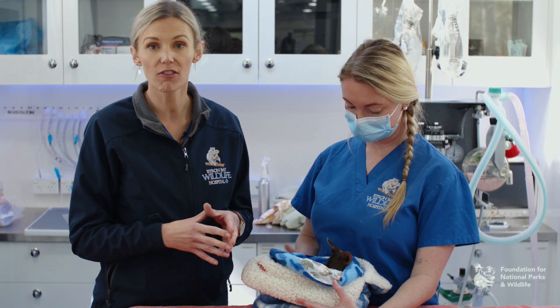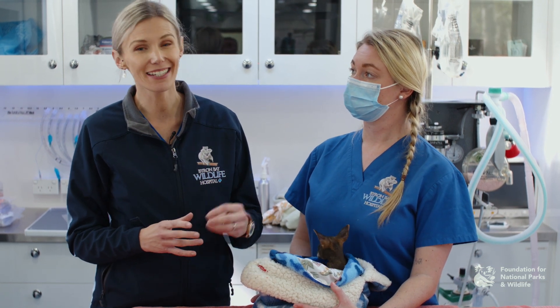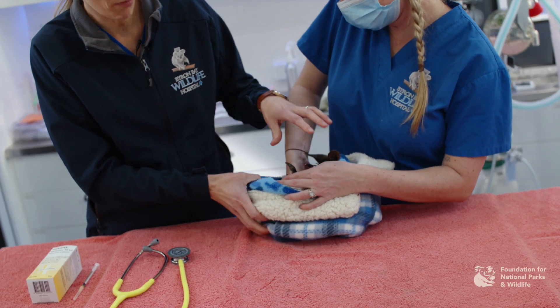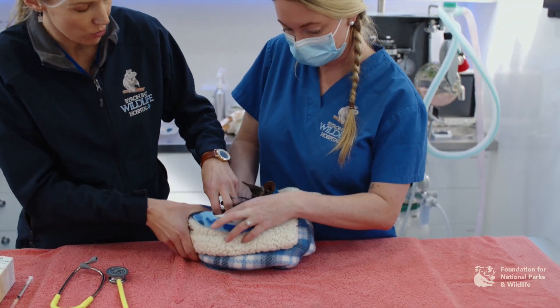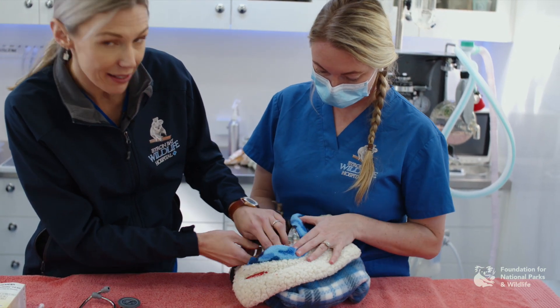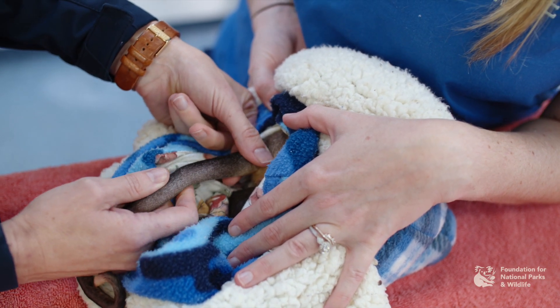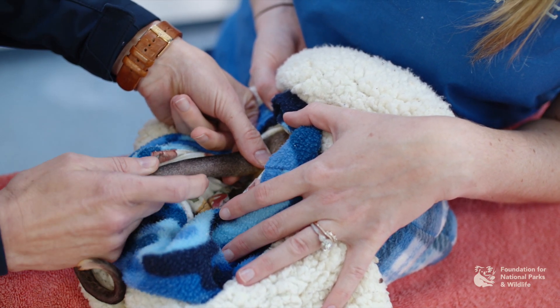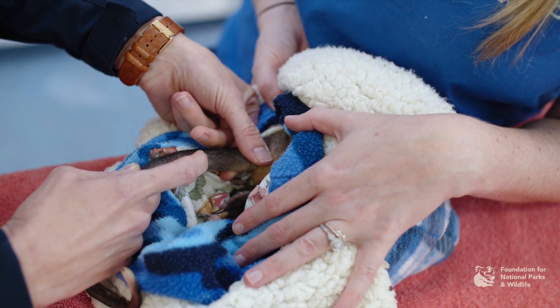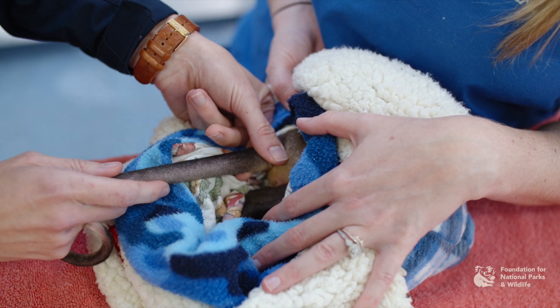With your macropods, probably the easiest place to try first is the lateral tail vein or your medial metatarsal vein, because they're going to be bigger and also easier to do with a conscious animal. You can keep your macropod in his blanket and keep him nice and calm. For your tail vein, if you hold the base of the tail, you allow the pressure to build. You'll actually see a faint line going down the side of the vertebral processes, and that is your tail vein.